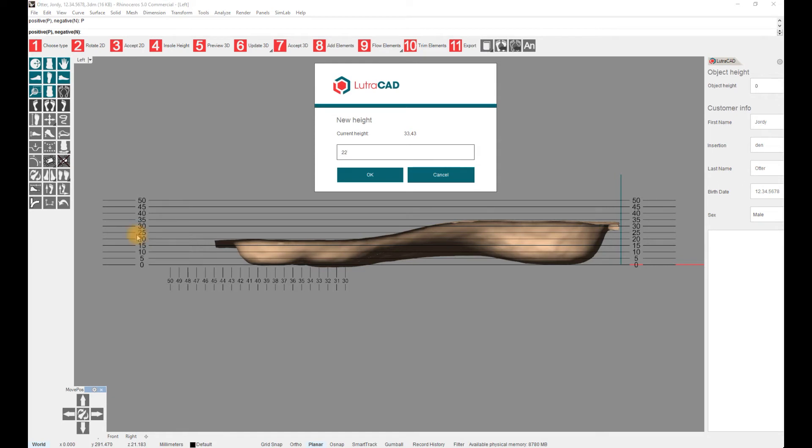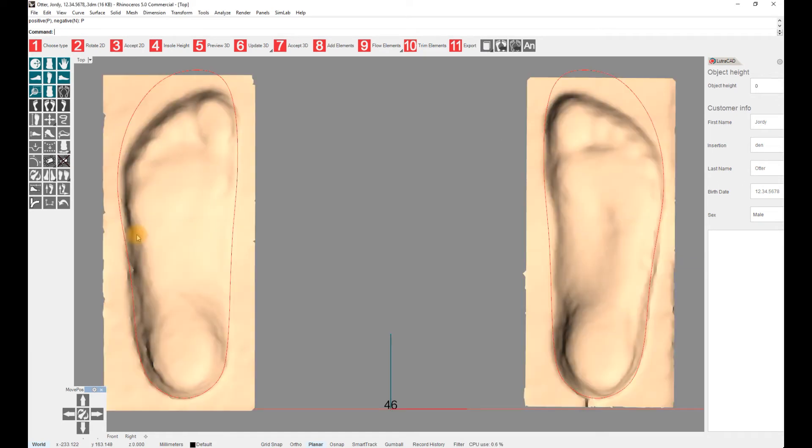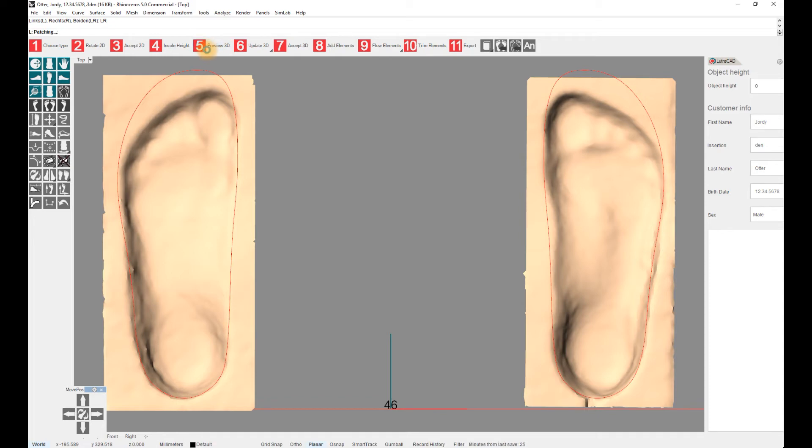To create a preview of our full contact 3D insole, we move on to step 5, preview 3D. It will take a couple of seconds to generate an insole. The time it takes depends on your settings and hardware.